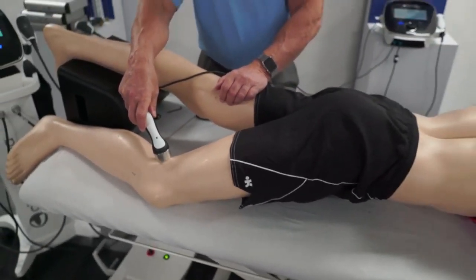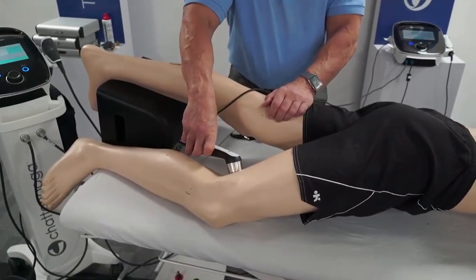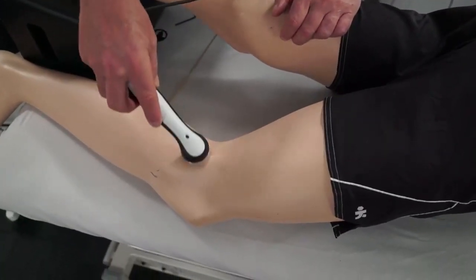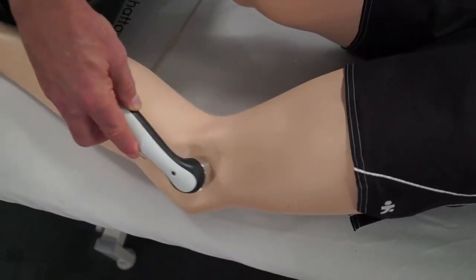The alternative is you can cover the whole area, but make sure that you keep it moving over that whole area up and down using a scanning technique so you don't miss any of the affected area.